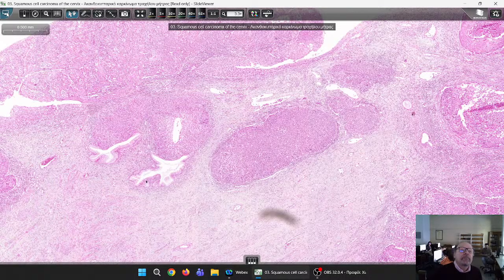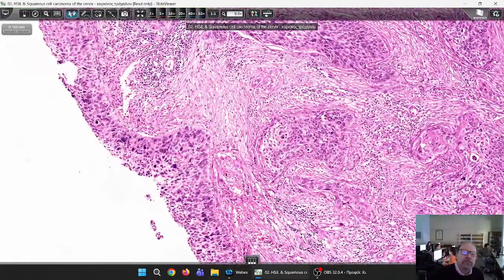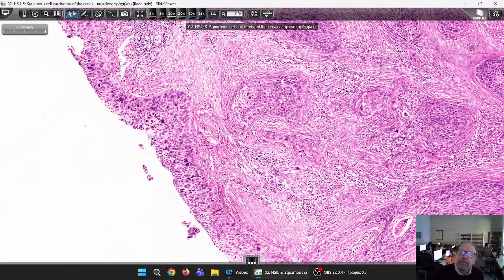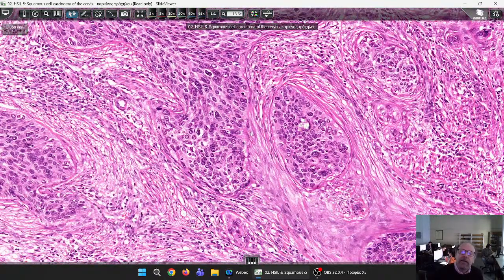On the contrary, in the other slide here, you can see the superficial epithelium with high-grade SIL or in situ carcinoma. These are too close. However, look here, what's going on. Look at the margin of these downward proliferations. It's clearly irregular. And furthermore, you can see that the stroma between these formations of atypical cells is clearly desmoplastic. So this is a sign of true invasion.